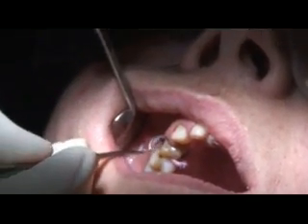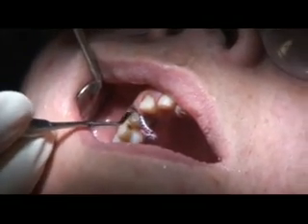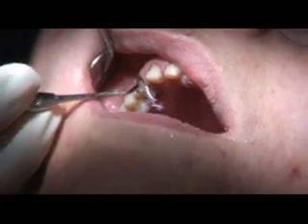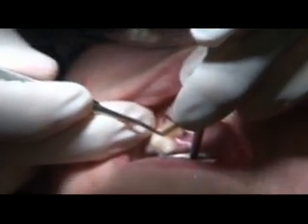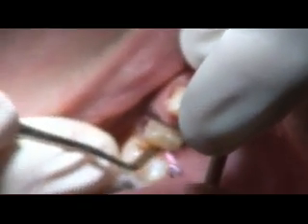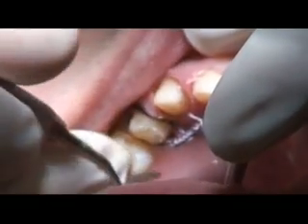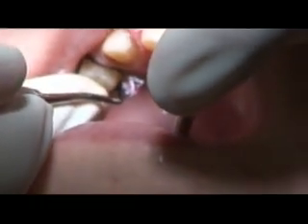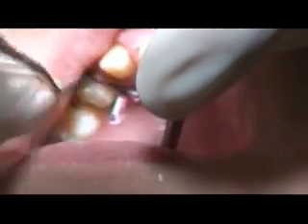Now this cord is a number 3. It's very large. Its purpose is not to stop bleeding. Its purpose is to push the gingival tissue away from the tooth so that when I take it out, there's a nice open trough for the impression material to slide into. When we take our impression, we leave the small cord in, but we take this large cord out. It's not so important that this cord be exactly the right length. Just need to be sure that we're in the sulcus every place.